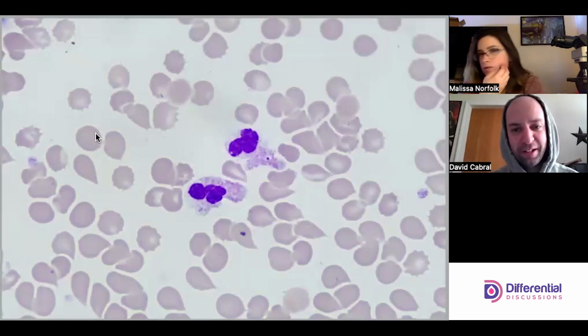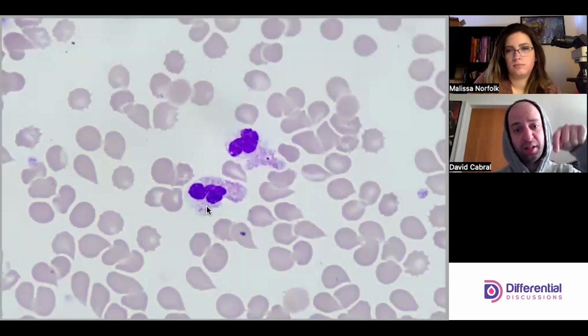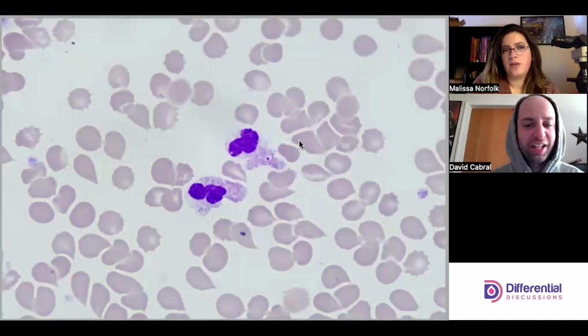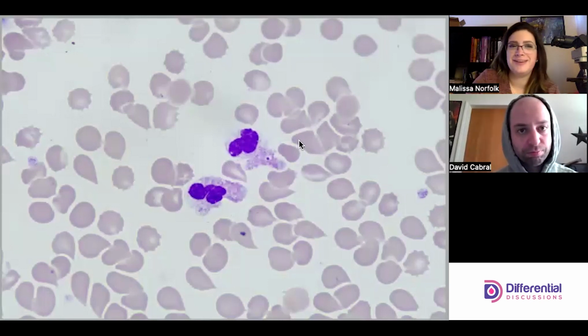So we think we have two neutrophils here, each with organisms in them. The neutrophil on the bottom, in the bottom of that cytoplasm, has a suspicious inclusion, probably a morula of Anaplasma phagocytophilum. And in the other neutrophil, I see a vacuole with something in there. It's a little non-specific, this inclusion, but given what we know about the slide, highly suspicious. I feel like both of them are kind of non-specific. They're not in your face, but given that we already know the slide contains anaplasma, exactly.